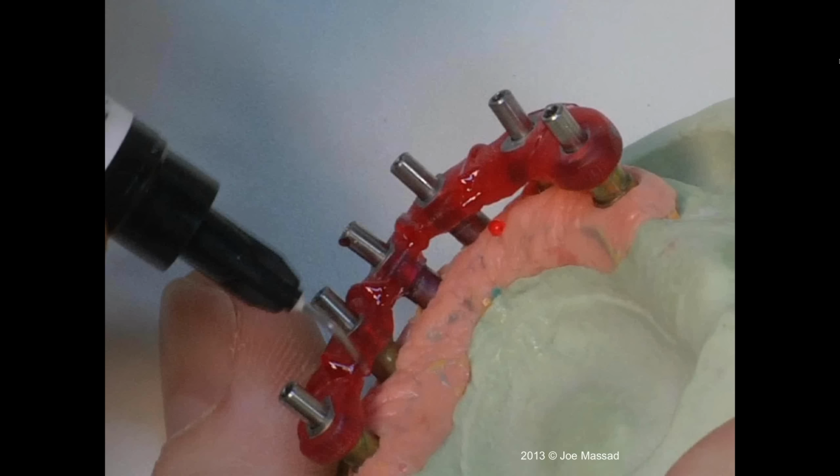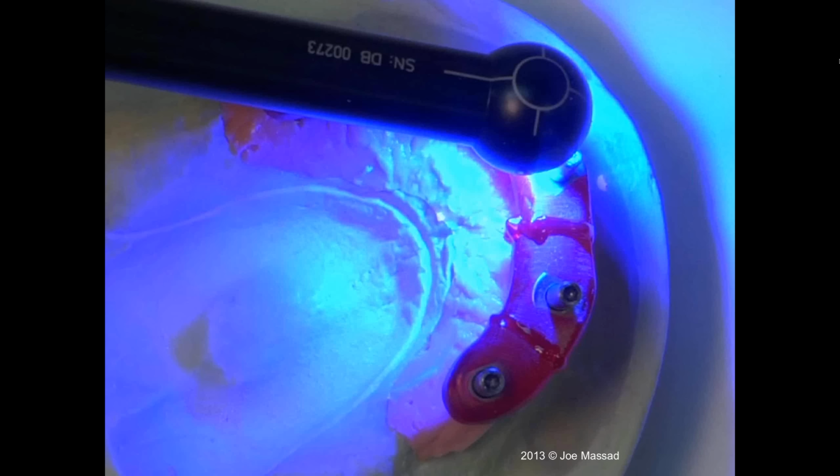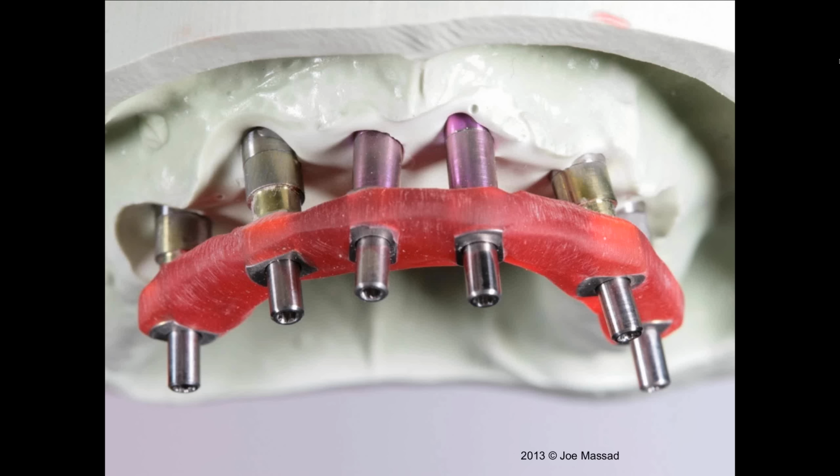Okay, so when it's completed and cleaned up, I need to go into the mouth and try that in. And I would always take a little diode laser and clean this out, because you want to make sure it goes in passively and seats. Initially I did what they call the one screw test. Many of you may have done this before. I only put one screw in it and took a radiograph. And with the one screw, if everything fits well, everything should actually seat.